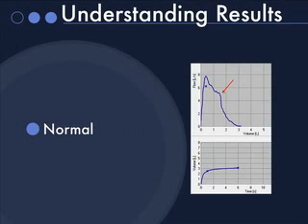This is a normal test. Notice that the flow goes straight up from the baseline on the flow volume tracing, and that the volume increases constantly on the volume time tracing. The hump at the arrow is a normal finding, particularly in young women.